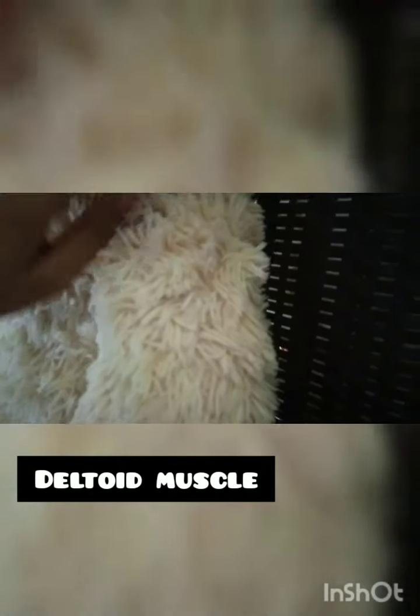Okay. Since our patient is adult, we have to administer the medication to the deltoid muscle right here. The deltoid muscle site is located by palpating the lower edge of the acromion process. Here, the end of this bone. And you have to measure it like this, and the injection site would be here.